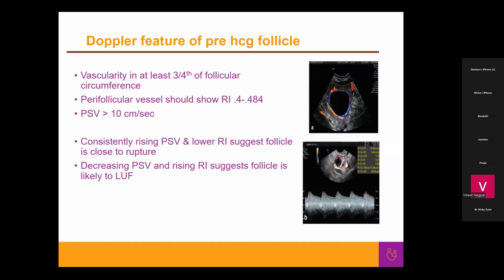See, the problem is, if you are able to do color Doppler and a good study, then it is very helpful. But there are many technical problems besides the learning curve. There are other technical problems depending upon the ovarian position, and your machine has to be actually very good, and the color settings have to be right. All those things are limitations of color flow. But if you are able to do it, it's certainly helpful. But I can't say it is mandatory. It is definitely helpful, but not mandatory.